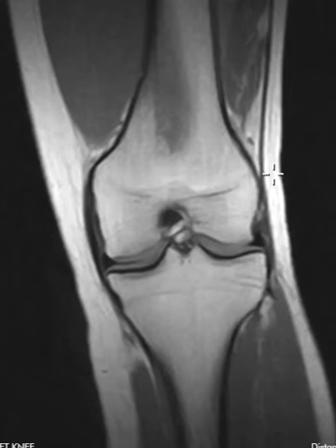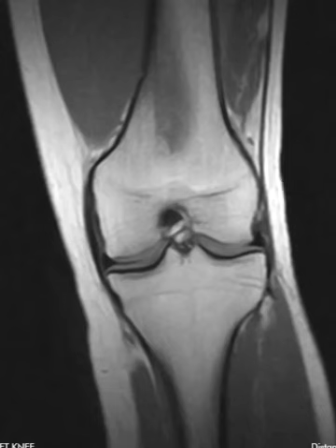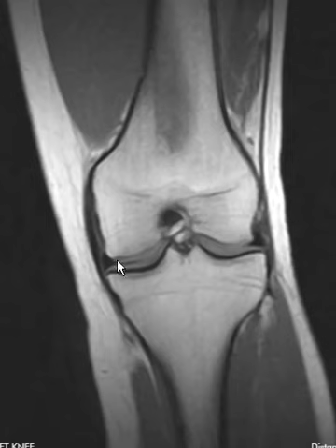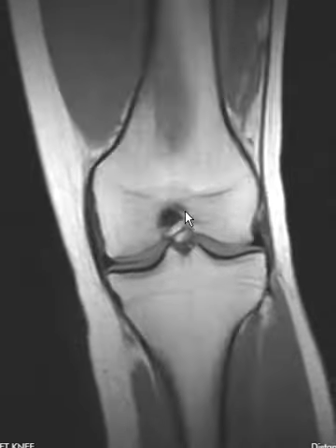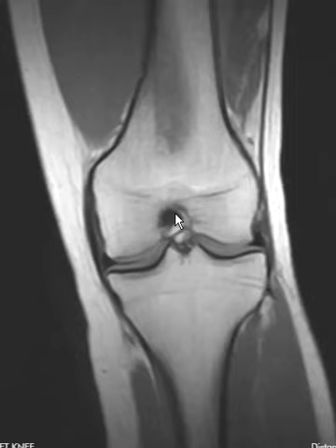She had been scanned about a year ago and had an ACL tear at that time, and now she comes back with continued knee pain. If we look on this view here, we see that her lateral meniscus looks good, medial meniscus looks good here in the region of the body, no arthritis. The ACL we don't really see here — it should be a vertical band here. The PCL looks normal.